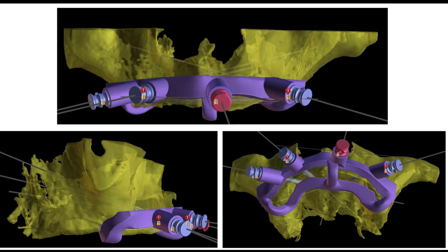So we went into Blue Sky Plan and generated the guides. This was going more of my old-school method using swappable guides — there's a time and a place for that. I've shown many cases where we use the stackable system, and those are great, but they're a lot more effort. These cases are really straightforward: once you've got your tubes and implants positioned, you simply make a guide, and then you make bone reduction cuts about a millimeter supra-crestal to the implant platform, which generates your reduction windows.